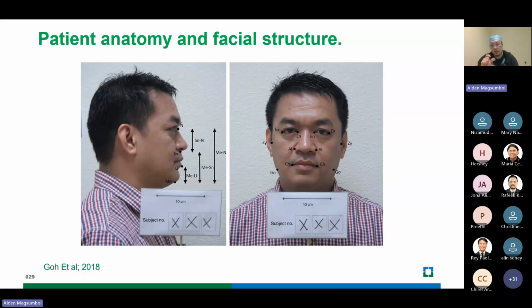Their findings on that trial concluded that nasal masks led to better treatment outcomes with lower residual AHI and better comfort, while oronasal masks were associated with higher pressure requirements and more complaints and discomfort.